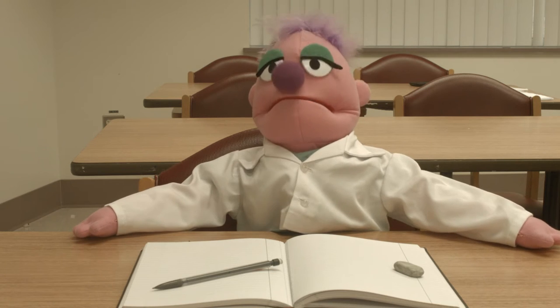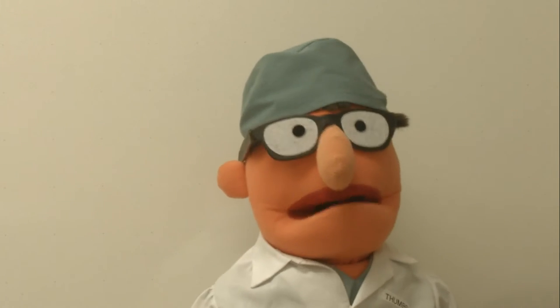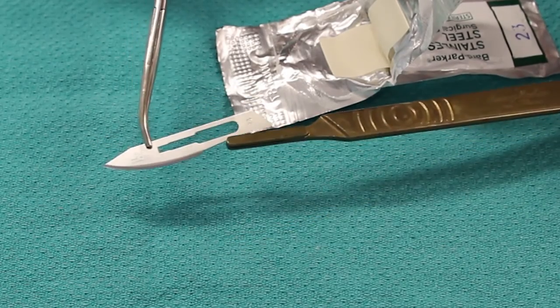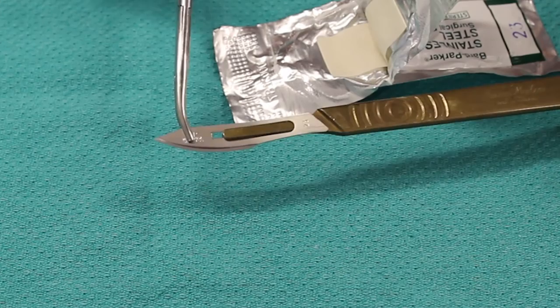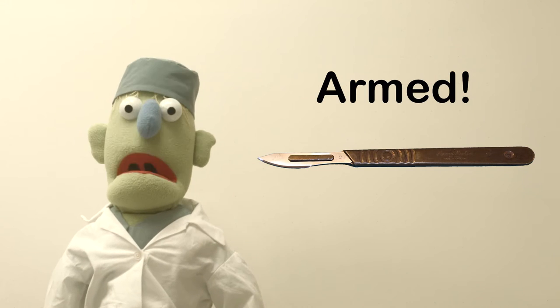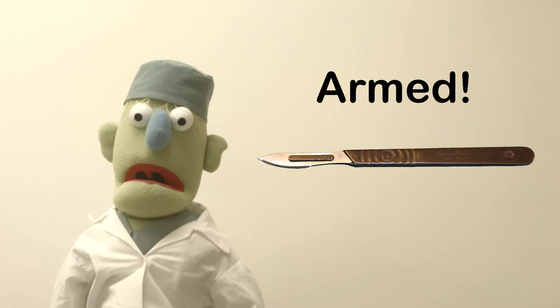So how do you put the blade and the handle together? Good question, let's take a look. To mount the blade, take it out of the package and hold it with the instrument. Don't ever hold it with your bare fingers unless you like being cut. Then slide it on until it locks in place — just like that. Click. Now your scalpel is armed. It's like a weapon, so show it some respect.